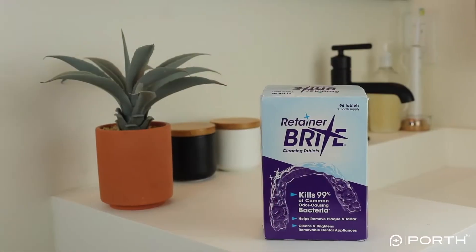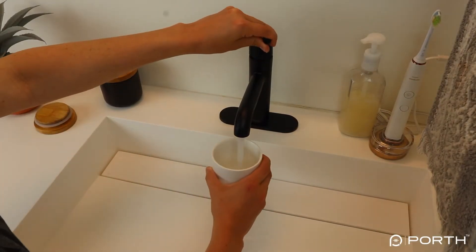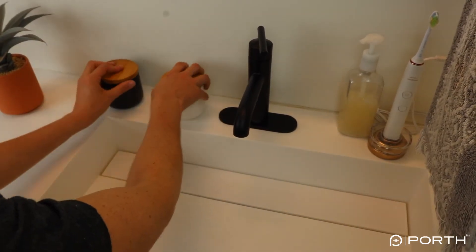In the morning I would soak my aligners in a solution of room temperature water and a Brite tablet as I got ready for the day and had my coffee. Now the Brite tablet instructions say to use warm water, but I would avoid doing this because it could warp your aligners. Since this morning soak was 15 to 20 minutes for me, I never had a problem with the Brite tablet dissolving in room temperature water.